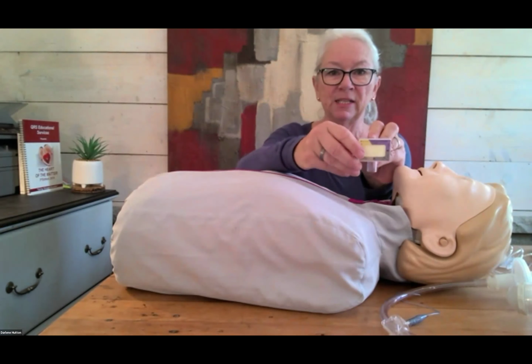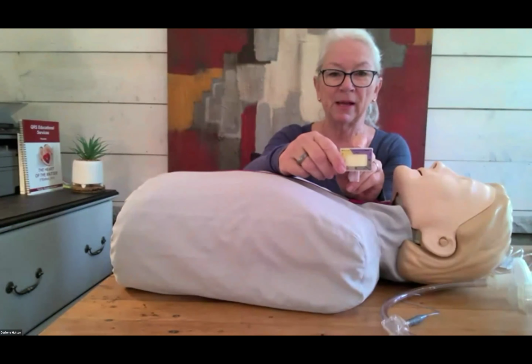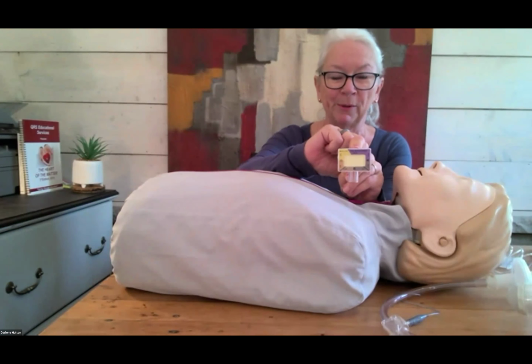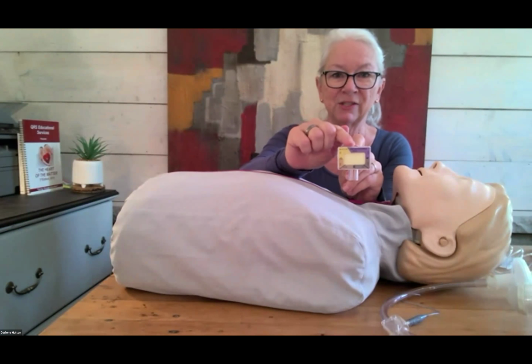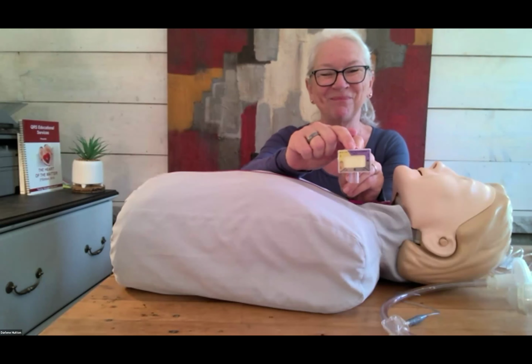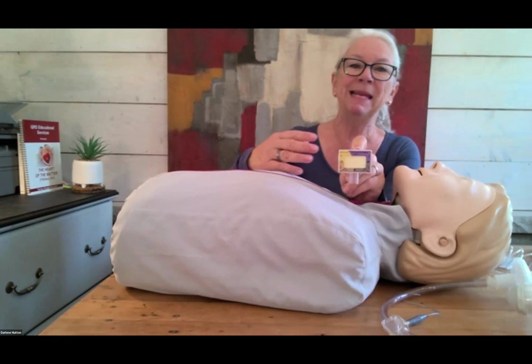This is the other way to determine that it is in the correct spot. When you originally take this out of the wrapper, the inside part here is going to be purple. Once it's attached to the endotracheal tube and you've done your 5-point check and you are in the right location, the patient will now be exhaling carbon dioxide.